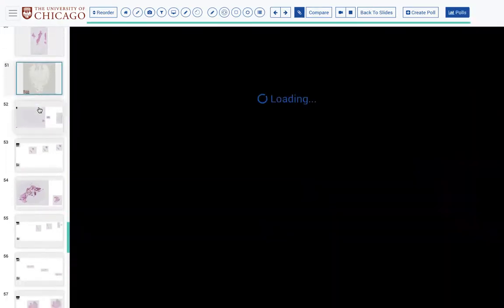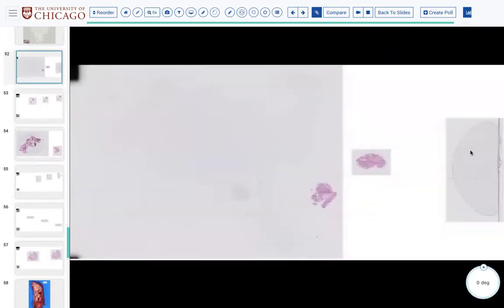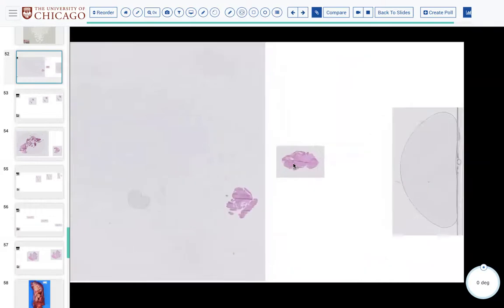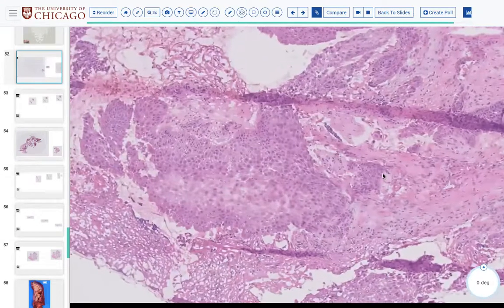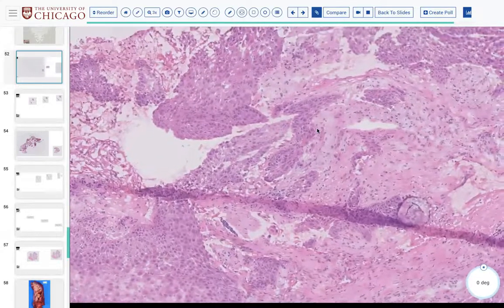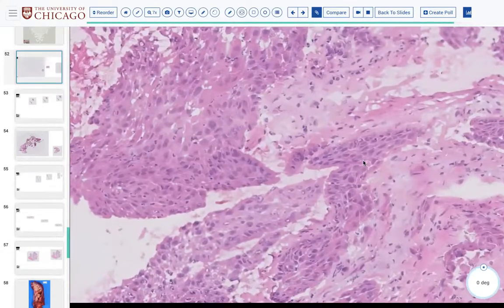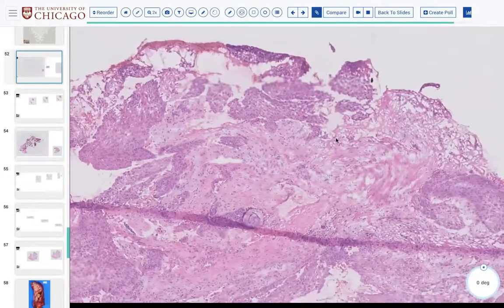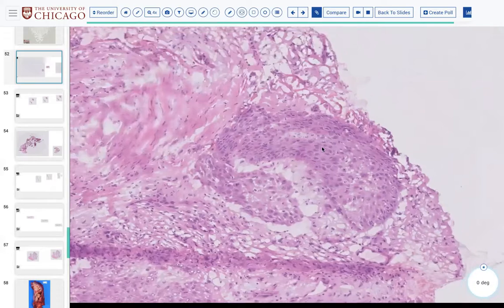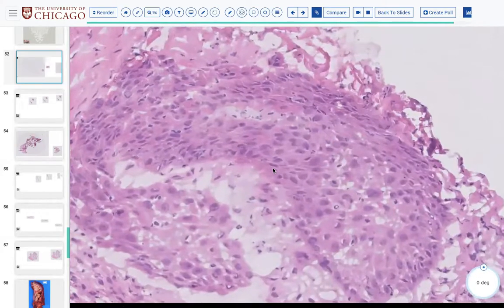Okay. All right. The next one is an interesting one. This is from the mandibulectomy for squamous cell carcinoma. And so the first one you're getting is a biopsy of a lesion on the retromolar trigone, which is this guy. Squamous cell carcinoma. Yeah. This is very worrisome. Maybe even all over. Invasion. Yeah, it looks highly worrisome.